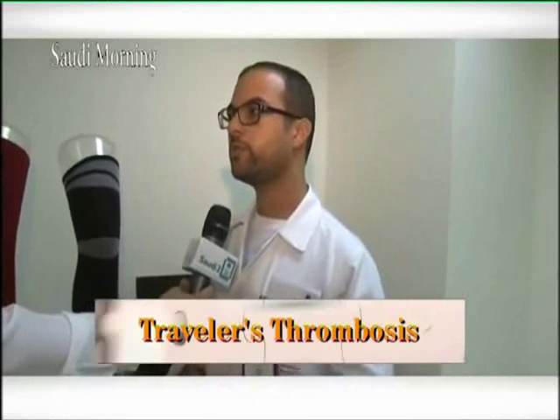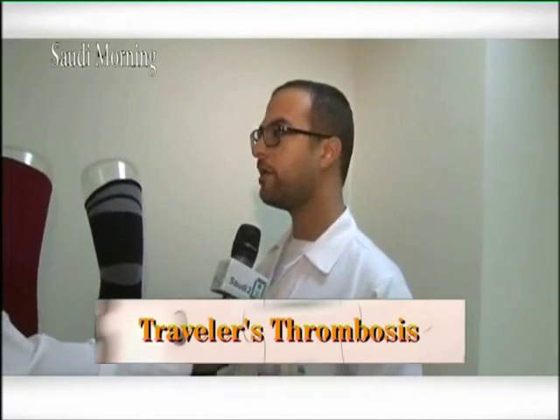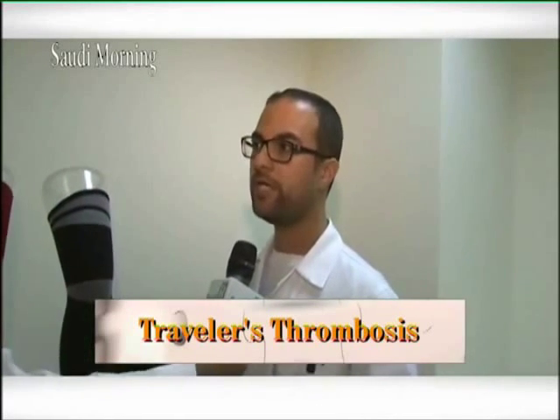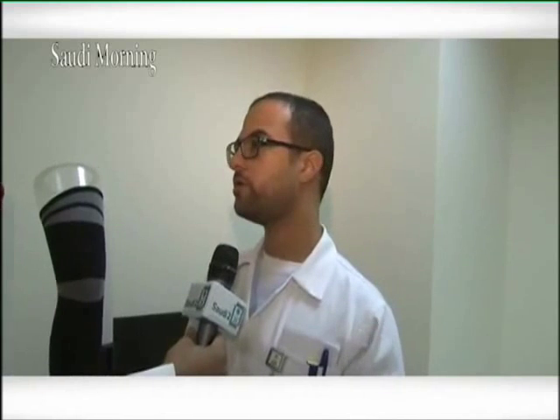We are not taking any measurement for the shoes. The stocking can be worn like any stocking, and the patient can wear any shoes that he likes over it. So we are not preparing any shoes for the patients, only issuing a stocking or pressure garment for them.